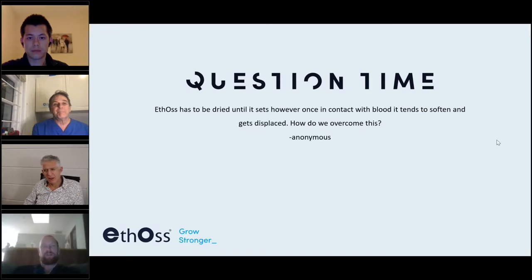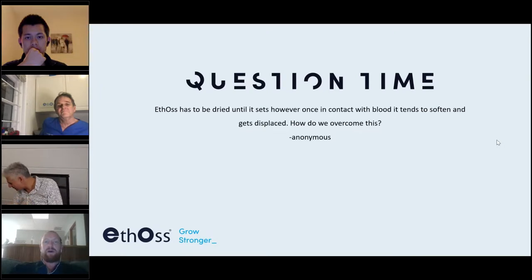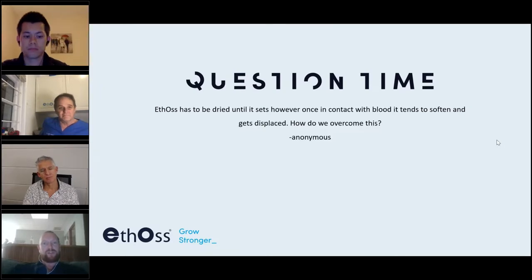I totally agree with Johnny's comments, but I also have, in some cases when the patient has high blood pressure, when they have some medications that they tend to bleed a little bit more, these cases are the most tricky ones. And I start using tranexamic acid, and this is diluted in sterile saline, and we push this into the wound before we apply EthOss, and this tends to be much less stress when you try to suture everything up. So this is, in my opinion, a game changer, actually.